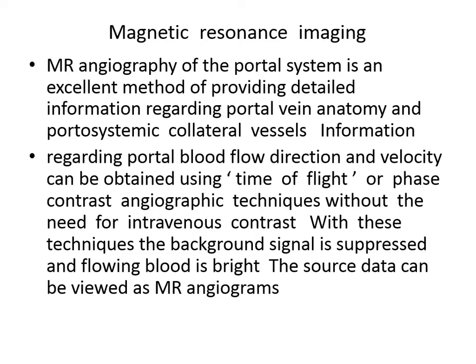It can show you the direction and even the velocity of the flowing blood in the portal venous system by MRI. Also, you can see the direction and the velocity using Doppler ultrasound. Is it important to know the direction and the velocity of the portal vein blood flow? Of course. First there will be decreased, slowing flow, then very slow flow, then it starts to reverse, flowing in the opposite direction, in the case of portal hypertension.